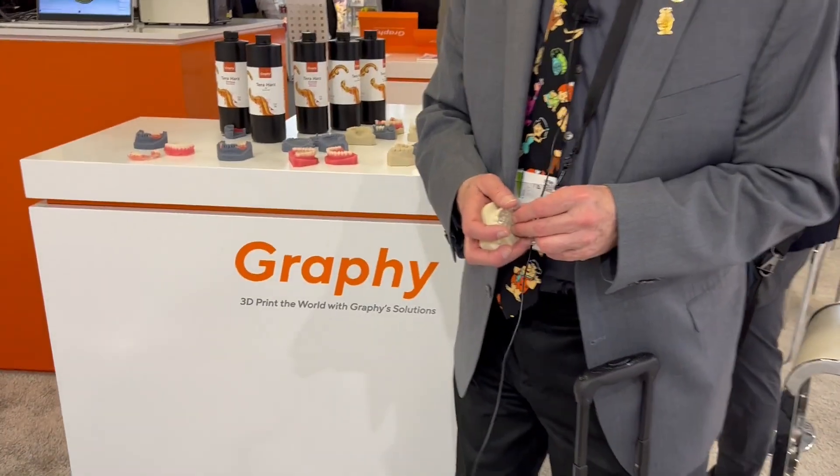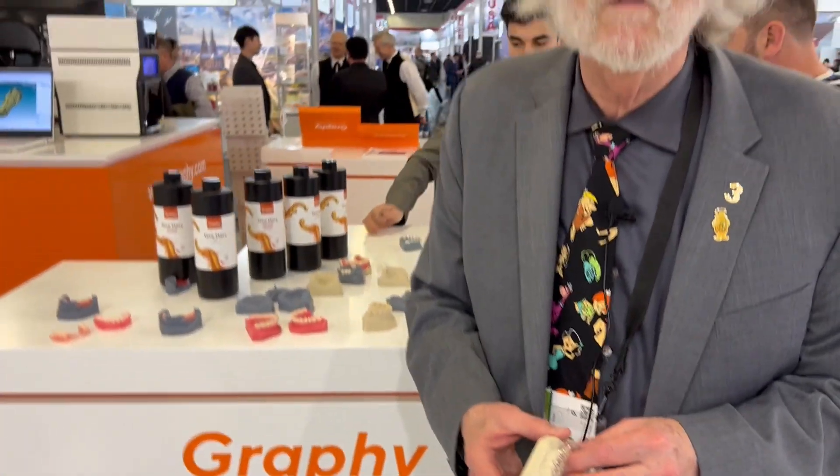Hey, it's Paul Feuerstein, and I just have to show you something unbelievable. This is a company called Graphy, and what they've decided to do is change the whole shape of aligners.